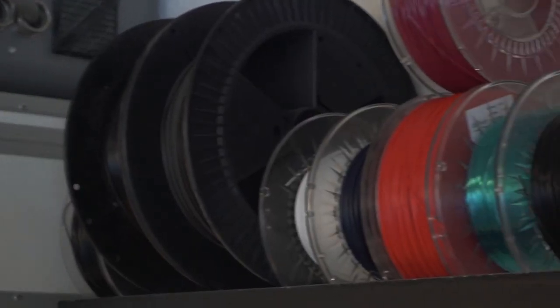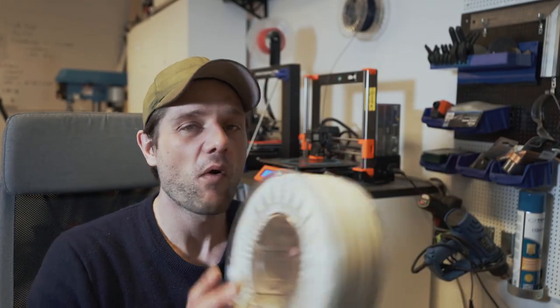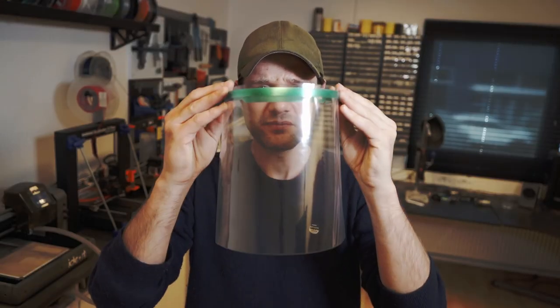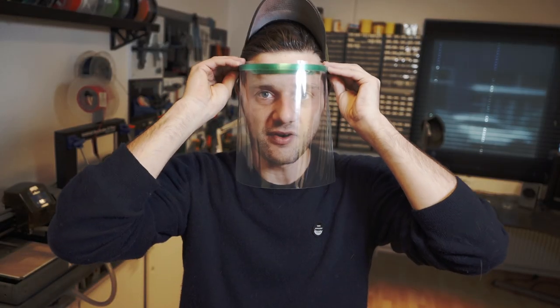Mick in the studio next door found this group and came in saying we got to do this. And of course we got to do this. We have two 3D printers and we have a lot of filament that is never being used. I have PC gray ABS — a whole spool of it. I've never used it and I have no idea why I have it, but now I can turn it into protective shields for the healthcare system. So let's make some protective shields for the healthcare system in Denmark to fight the coronavirus.